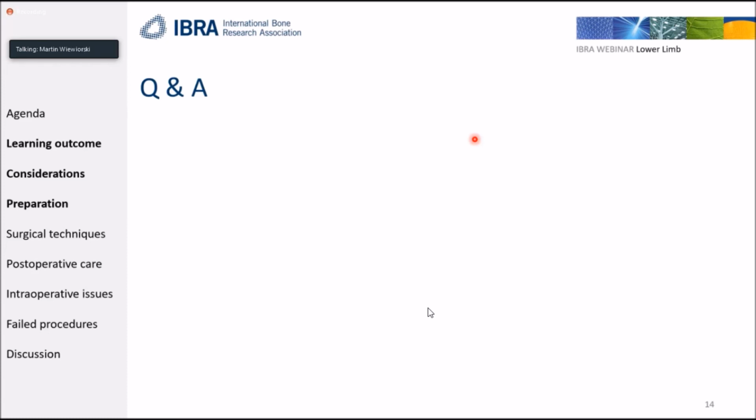The other question is, what about sesamoids? I don't know exactly what you mean by sesamoids. The sesamoids are subluxated in the hallux valgus, at least in my opinion. When you look in the dorsoplantar X-ray, I think basically they show you the original position of the metatarsal head where it started out.